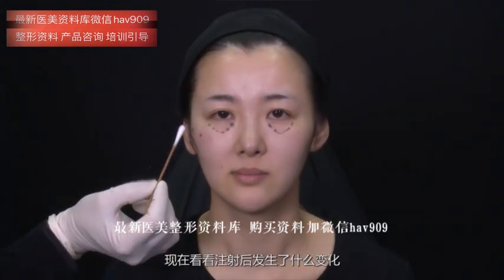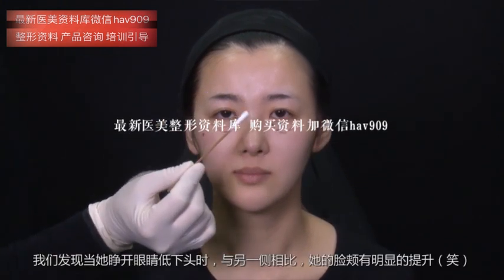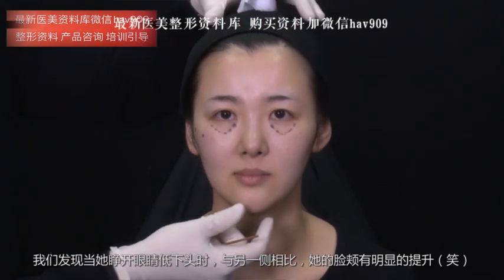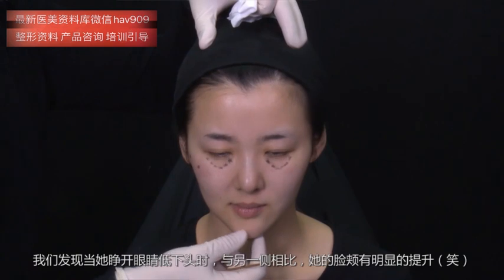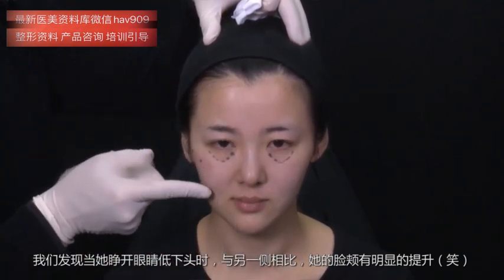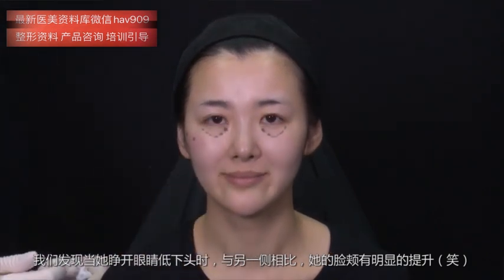Now observe what has happened after injecting. We notice that little by little her eye is opening, and when she looks down, we notice that her cheek is much more lifted than on the other side. Smile. Take a look, the beauty that she has on her cheek.